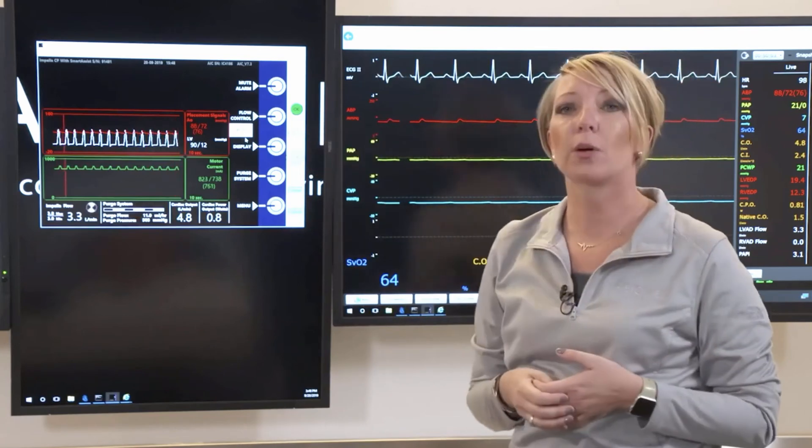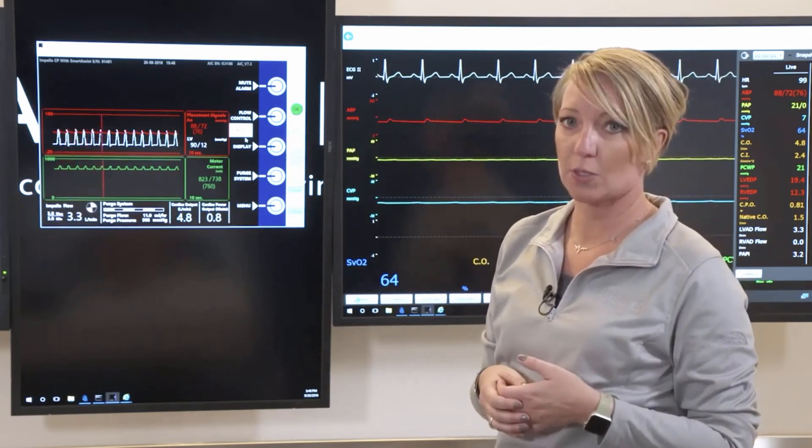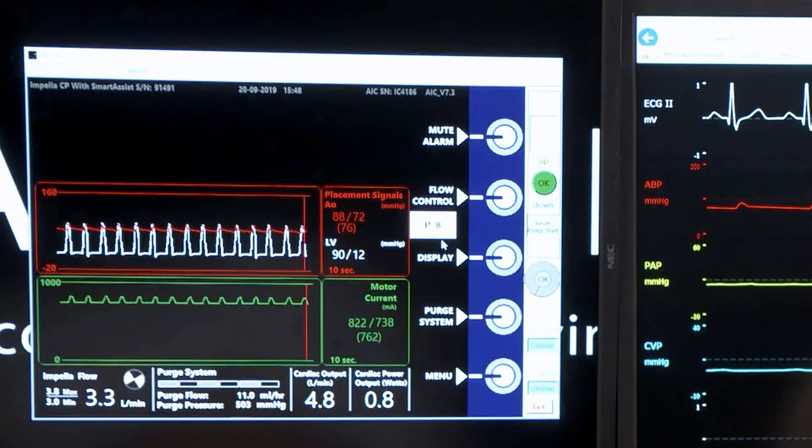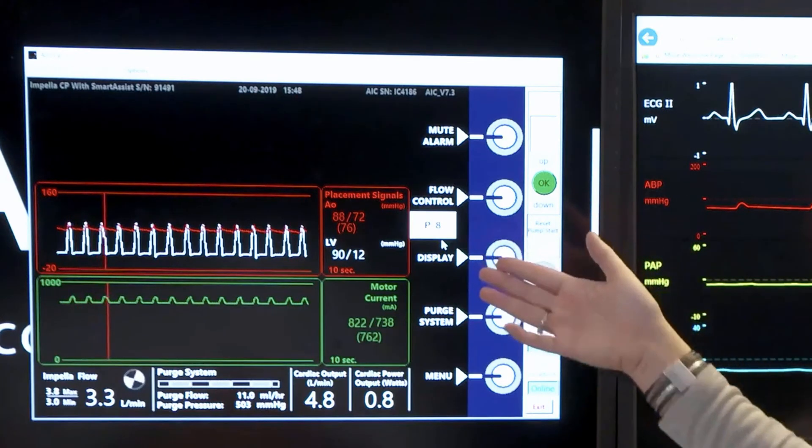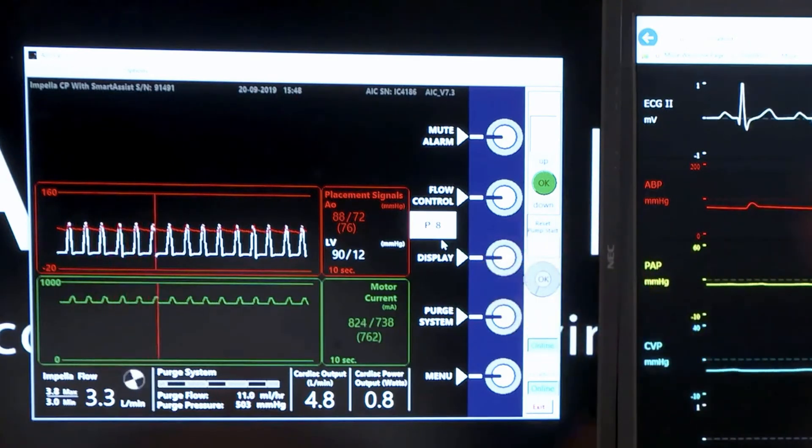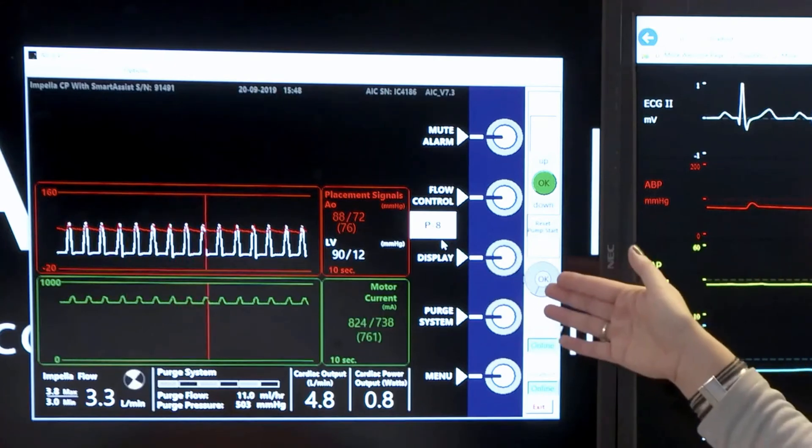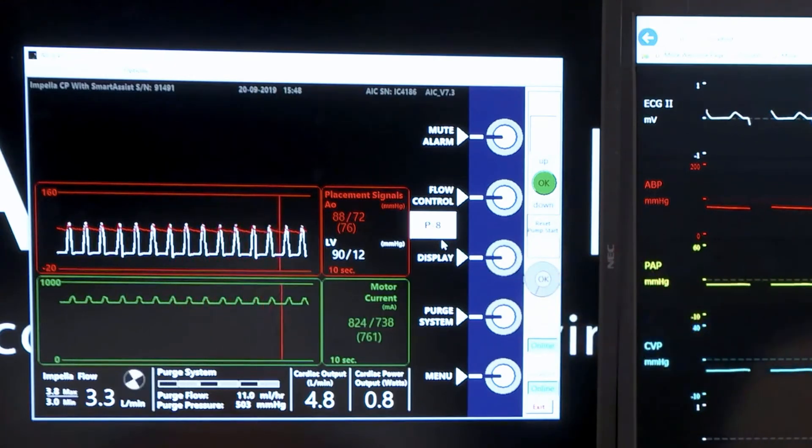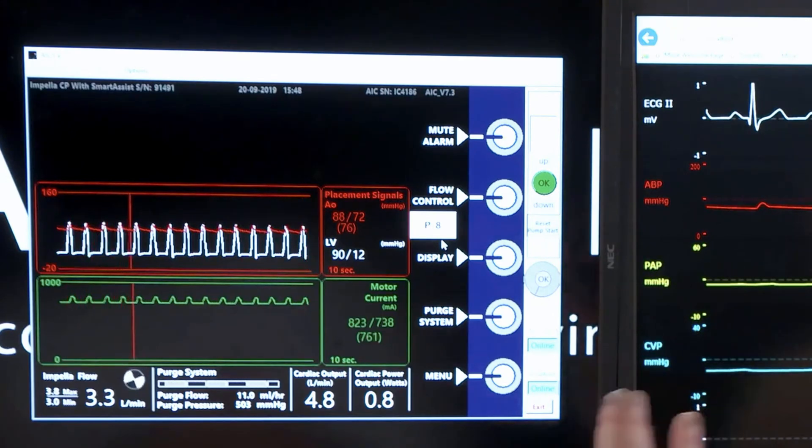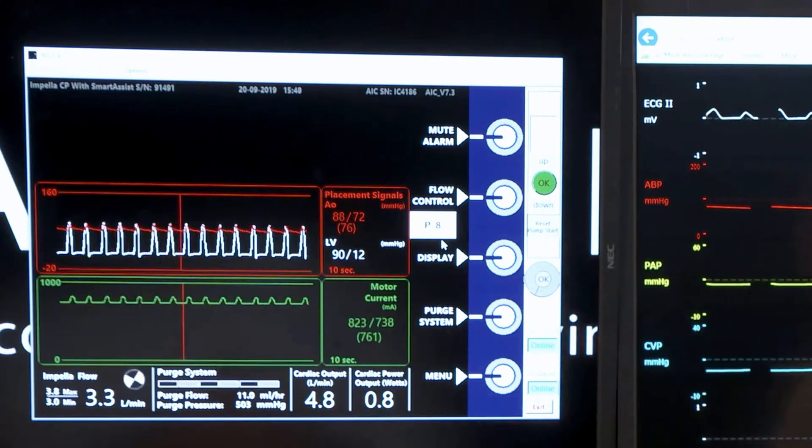Display is going to be anytime you want to change what you're looking at on the screen. 99% of the time you will have it on the placement screen, which is going to give us our placement signal and our motor current. But you could also use this display button if you wanted to look at your infusion history or show family the picture of where the Impella sits within the heart.